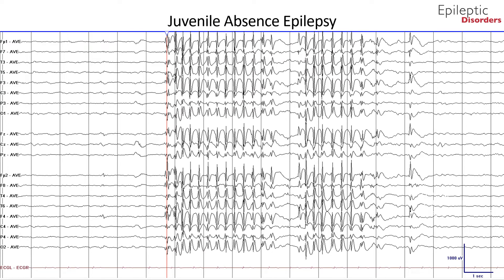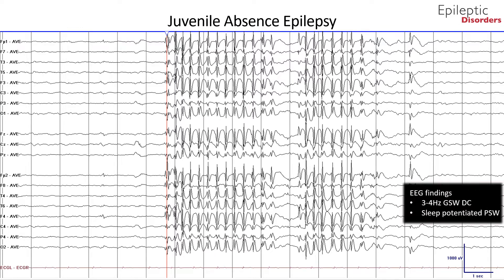This is the same EEG shown in average montage of the 13-year-old boy with staring spells and brief loss of consciousness, showing typical 3 Hz generalized spike and wave discharges. The sensitivity of this EEG has been altered for better visualization. Note the poly spike component outlined by the red circle and red star, which are enhanced during sleep.